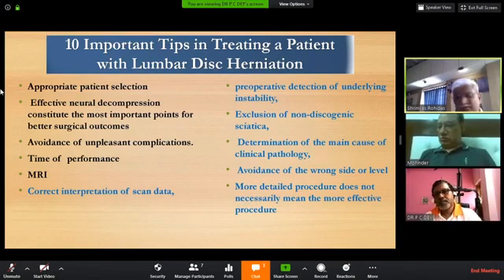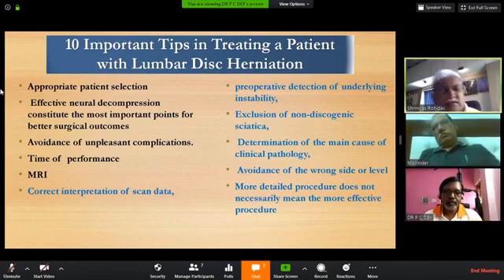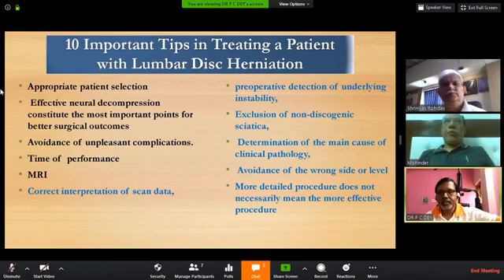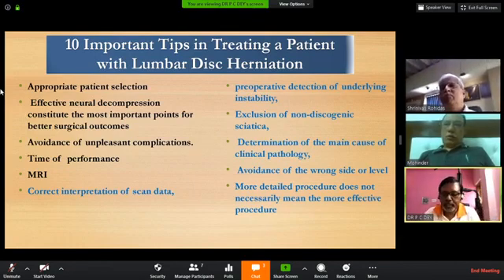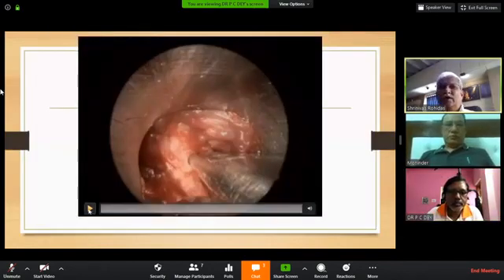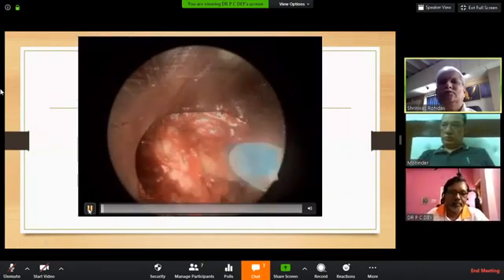Okay? So this means you want to say that you have to sacrifice a little bit of extra bone cranially. Yes. So that the field of vision, the interlaminar window, will be increased or expanded, then the field of vision will be better. You can retract the neural tissue medially comfortably, and then you can handle the disc, or you can search for the disc, right? So that is the problem. Your decompression of the neural tissue has to be good, otherwise you traumatize the nerve.